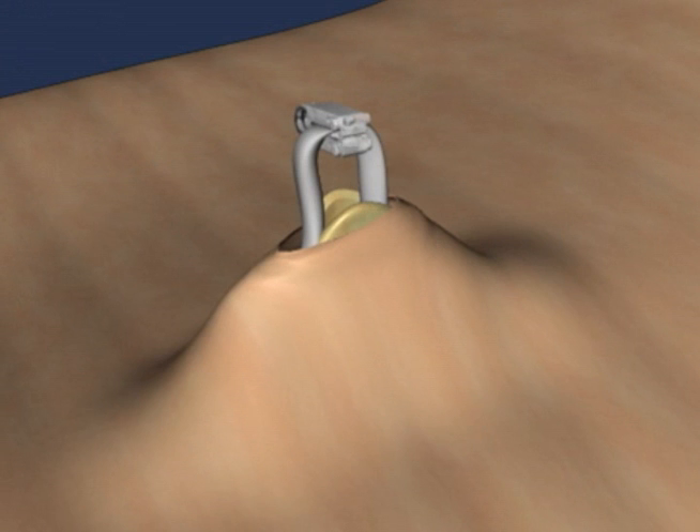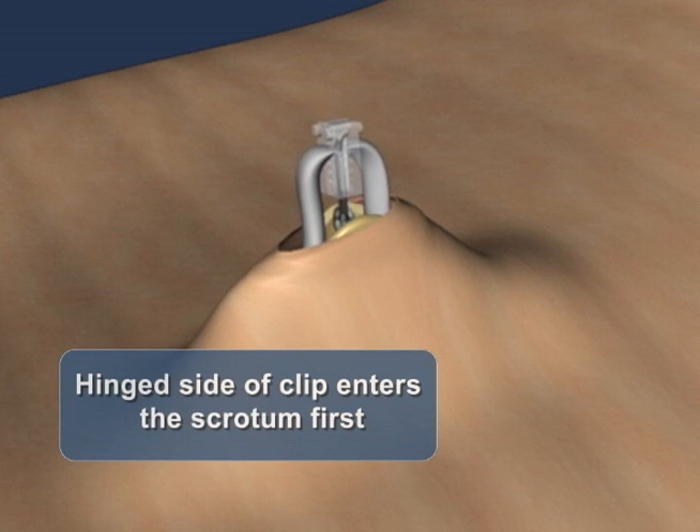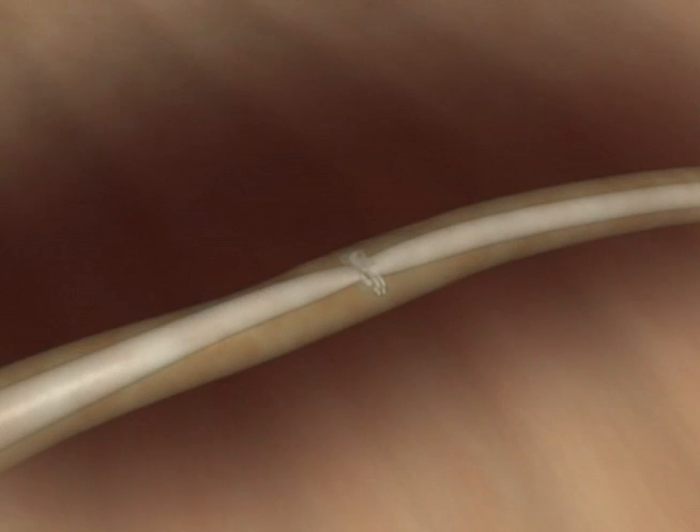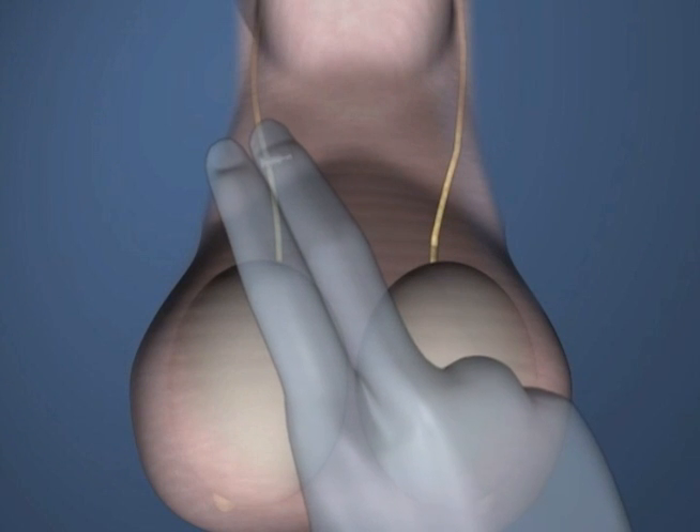With ProVas securely positioned on the vas, allow the vas to return to the scrotum with the ProVas clip positioned so that the hinge enters the scrotum first. Gentle palpation can help ensure that the vas has fallen back to its normal position.